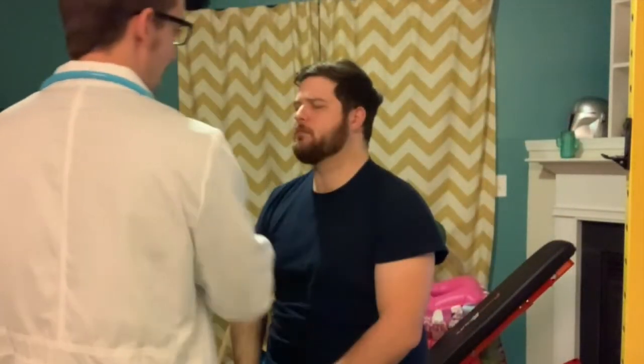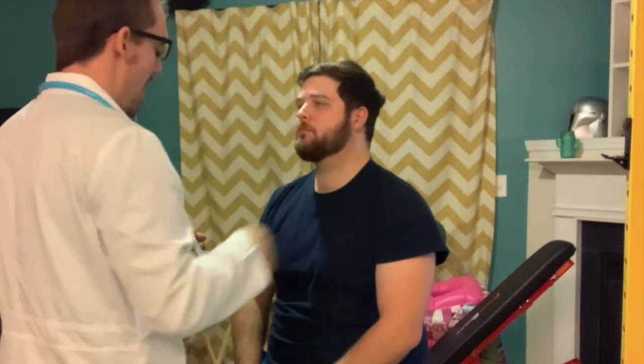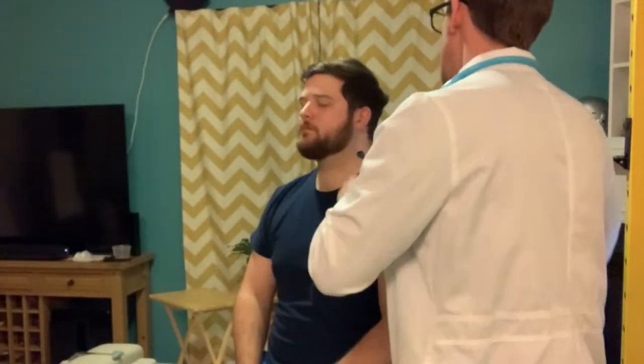And then I'm going to go on to the Rinne test. The Rinne test, I'll do the same thing. I'll ping the tuning fork and then I will hold it on the mastoid bone and tell me if you hear it, okay? And then I am going to hold it there. Let me know when you can't hear it any longer. And then I will place it next to your ear and you can tell me if you still hear it. And what I'm testing for here is whether or not he's able to process sounds better through air or through bone conduction, because that'll tell me a little bit about how the nerves are working, okay? So, close your eyes.